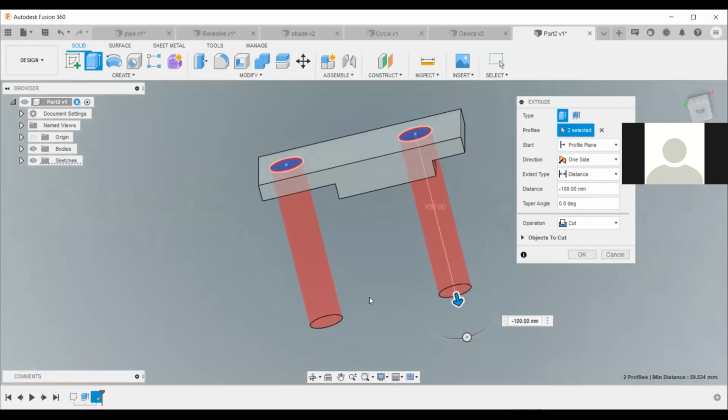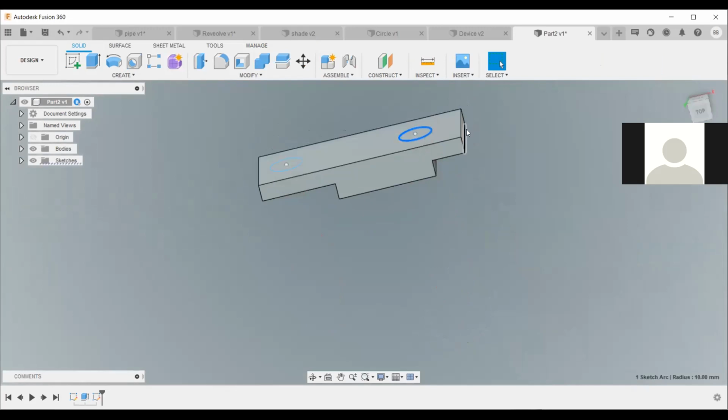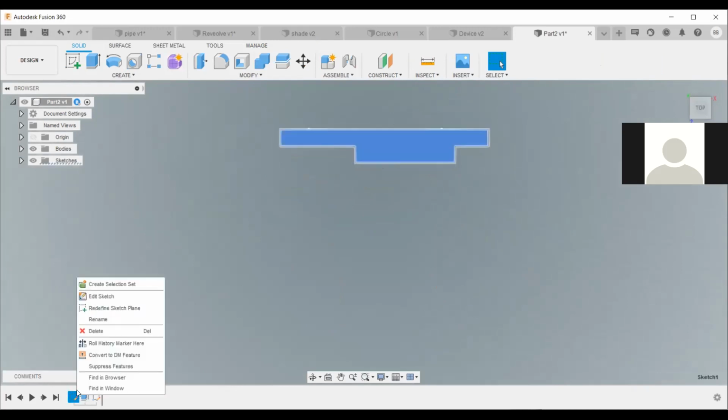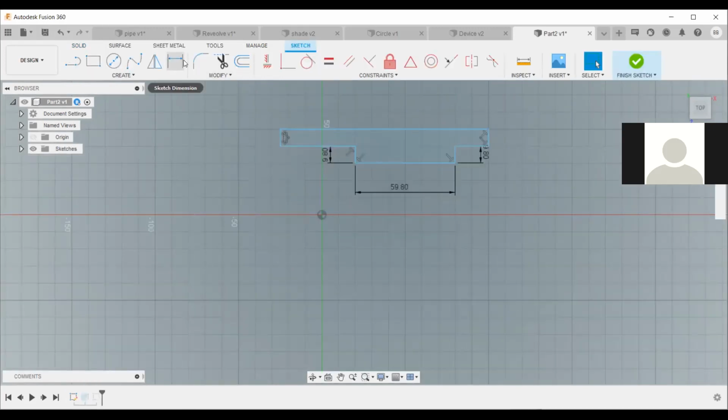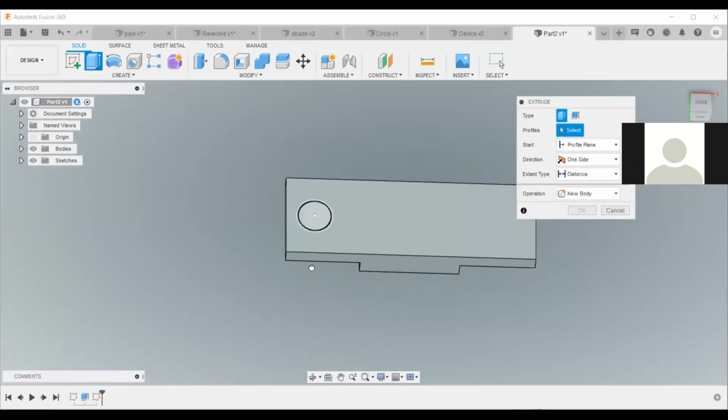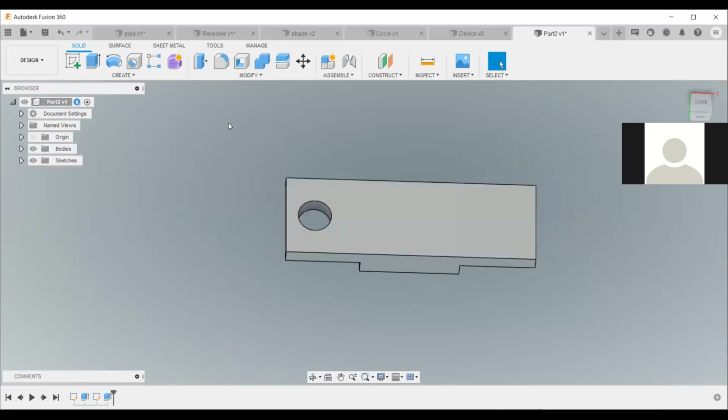Oh, shida, makosa. I need to play around with the size. So if you come here, you can edit sketch. So this length, you can increase it. I ought to have dimensioned the other one, but mnaona, so 125, so we can do even 150. Mnaona sasa, I've just increased its size so that I make it bigger. So this one, you can delete it. This other one, ya huku.